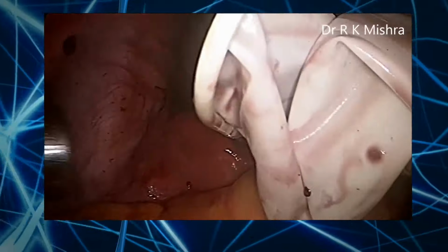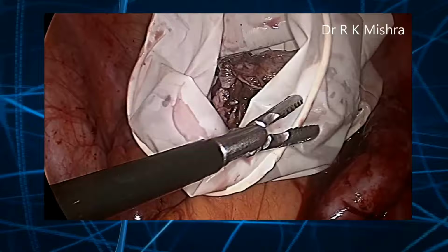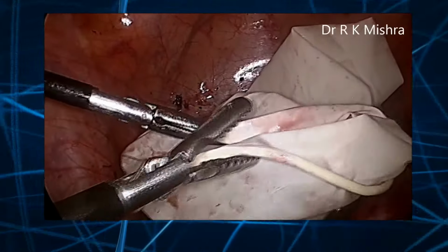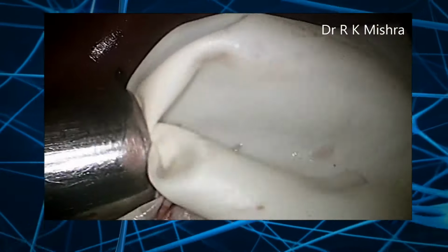You can use a glove as an endo bag, and then you can put the ovarian cyst inside it and catch both the edges of the mouth of the glove endo bag with the same instrument, and then you can pull the mouth inside a cannula, and the entire cannula will be taken together. So, pull it in the mouth and then everything will be taken together, just like how we do in gallbladder.